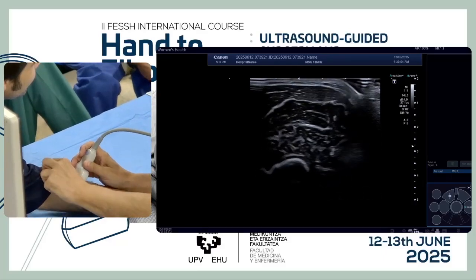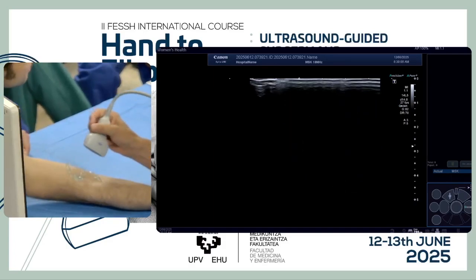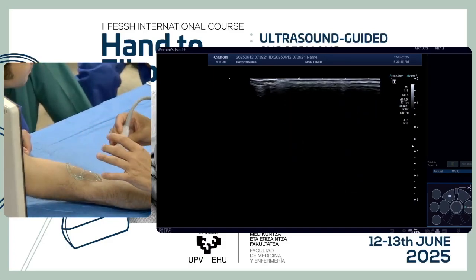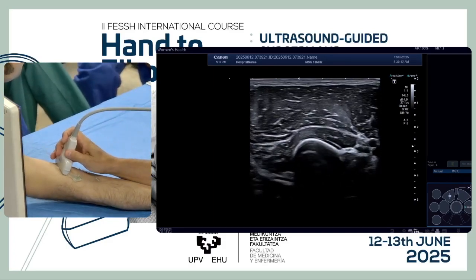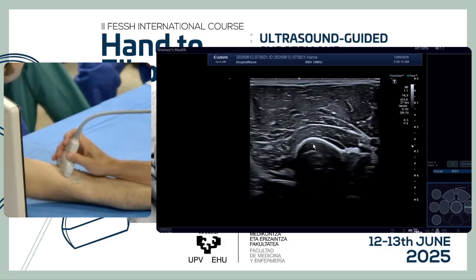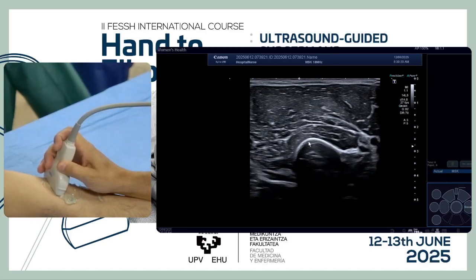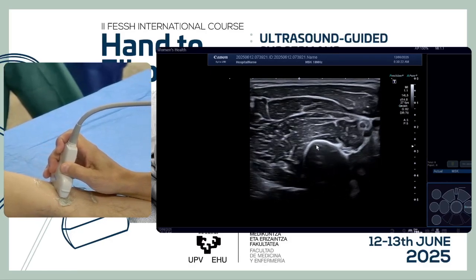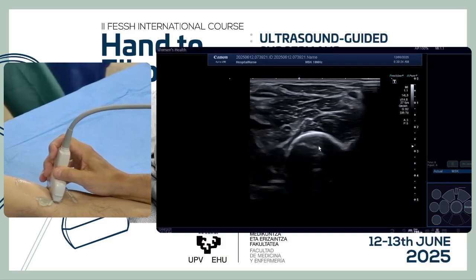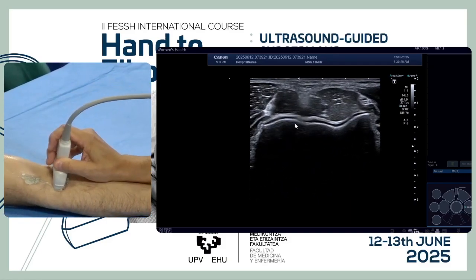I will explain my technique for the examination of the elbow. We usually begin from the ventral aspect, where we see the convex humeral shaft, and moving down until we see the flat surface of the elbow.